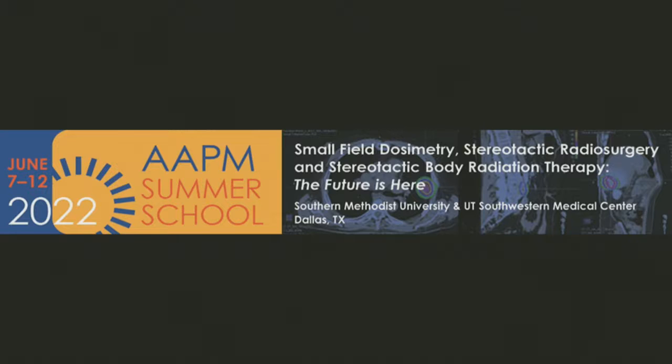Yeah, it is tricky. So for prostate in particular, like I said, we just now use MR SIM, so we forgo the CT. We don't have a CT, which makes part of the problem easier. And then for deformable image registration, we use a commercially available system. We use MIM. But we always look at it closely also.